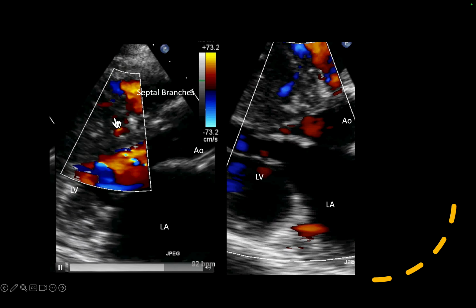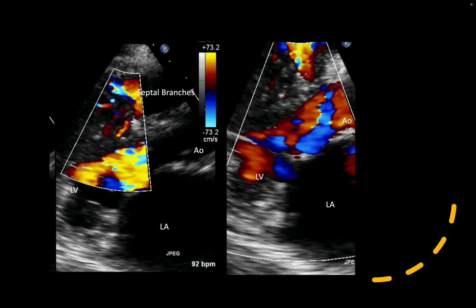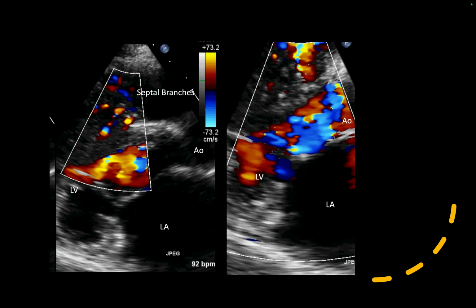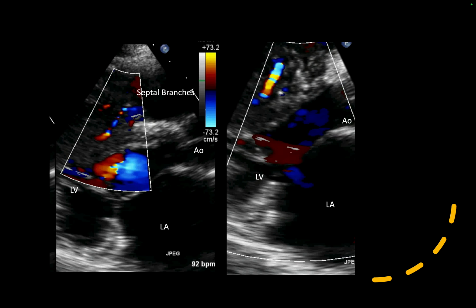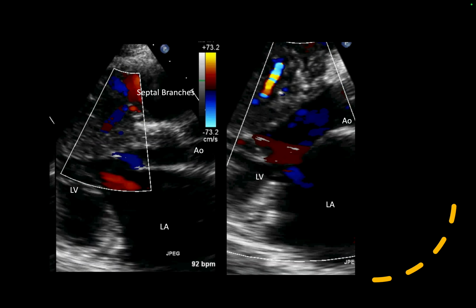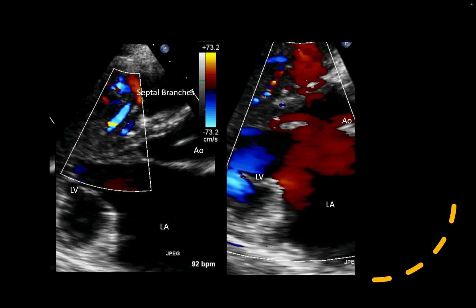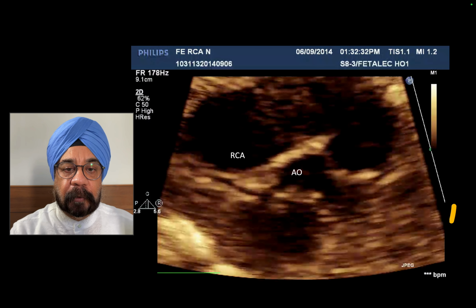Just there are three main coronary arteries which are there, which are the septal branches, and in case you're planning to do a septal ablation, you've got to be careful that this patient might require injection in 3 arteries because all 3 are big. So that's an important decision which can be made on visualizing the coronary artery.